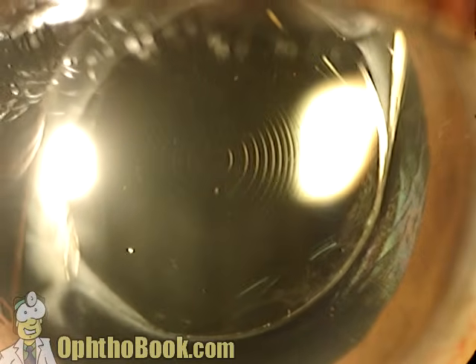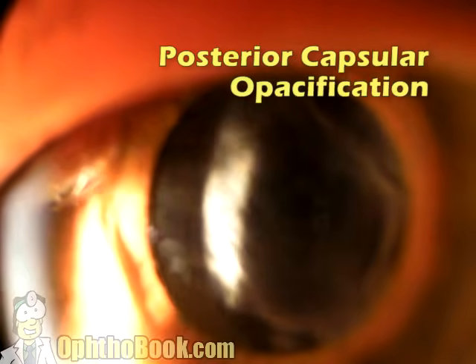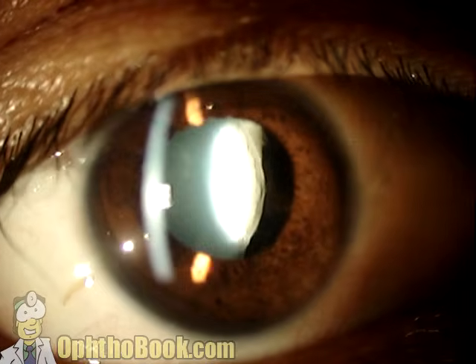because you can see these little concentric rings starting from the middle and moving our way out to help with distance and near vision. Here is our PCO, our after cataract, that's formed on the back of a completely normal lens. Very easy to use the YAG laser to get rid of that.